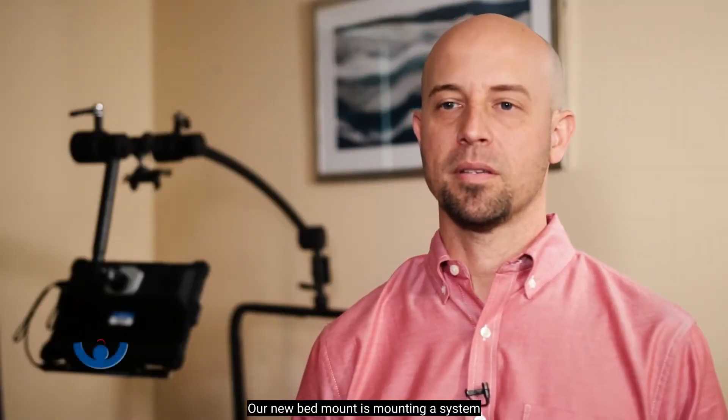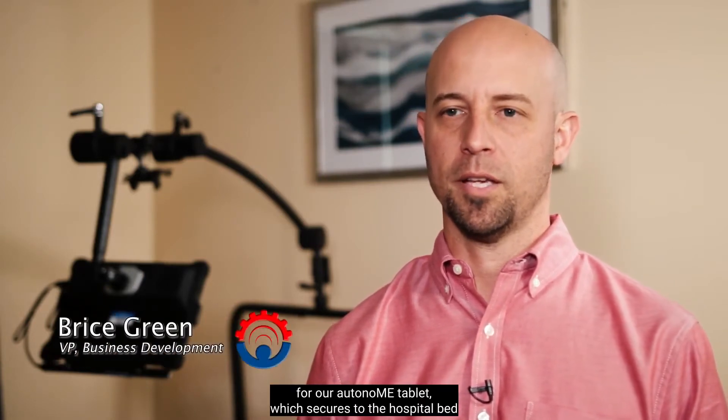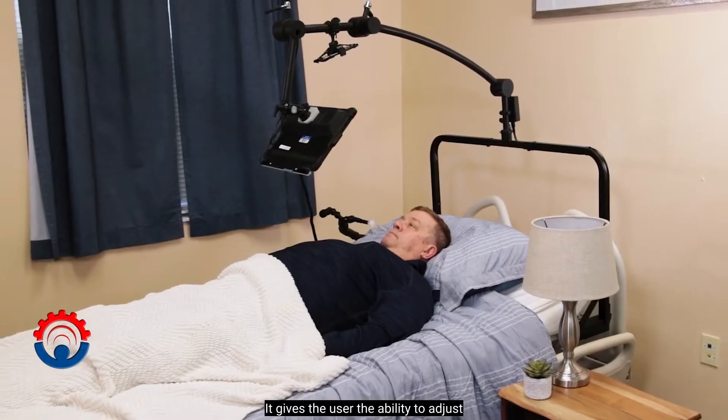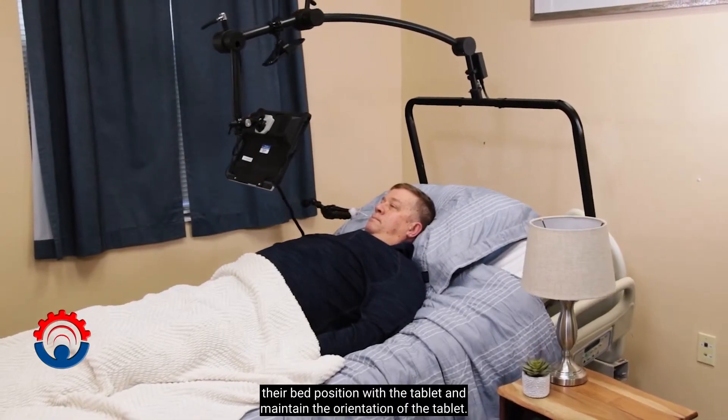Our new bed mount is a mounting system for our autonoME tablet, which secures to the hospital bed and allows the tablet to be held out in front of the user. It gives the user the ability to adjust their bed position with the tablet and maintain the orientation of the tablet.